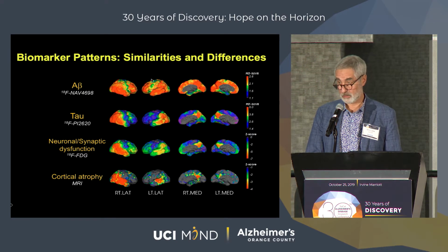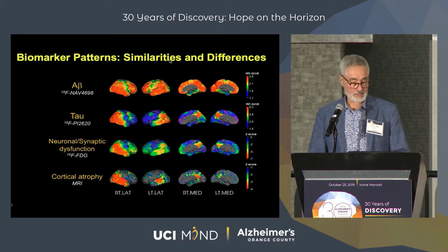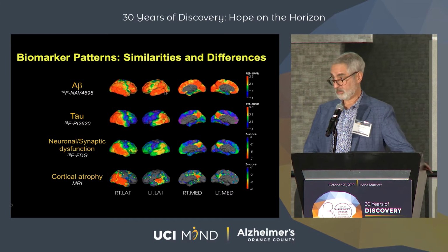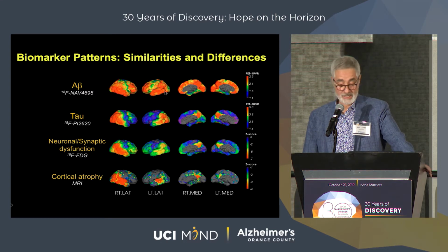This is the sensory and motor area of the brain, and that's an area of the brain that's generally spared in Alzheimer's by all these processes and doesn't show clinical involvement either. So again, I want to stress, yes, this is a person with Alzheimer's disease, but it wouldn't be unusual for a cognitively normal person to have that much amyloid in the brain.